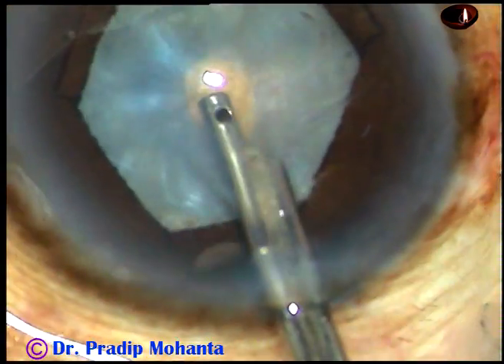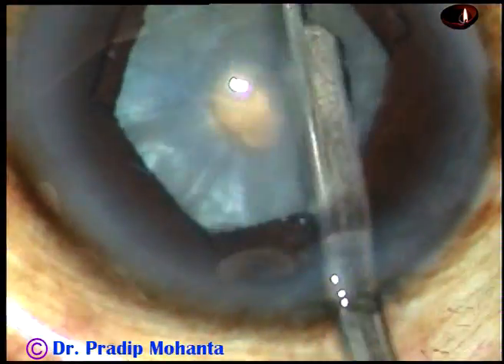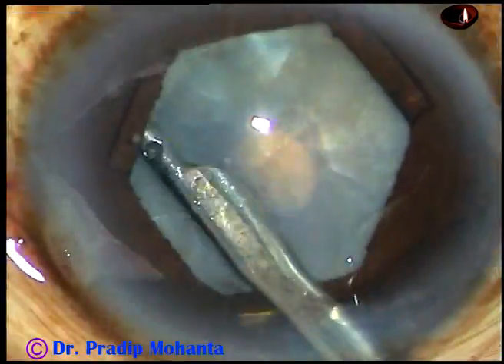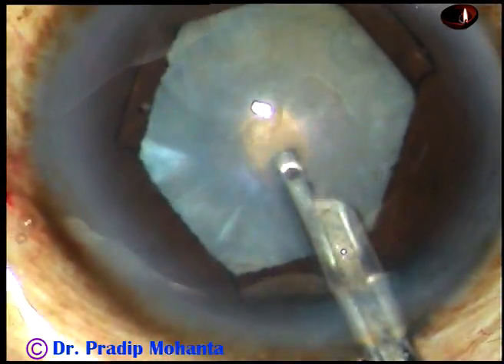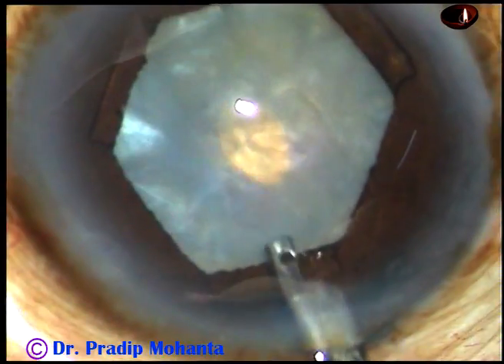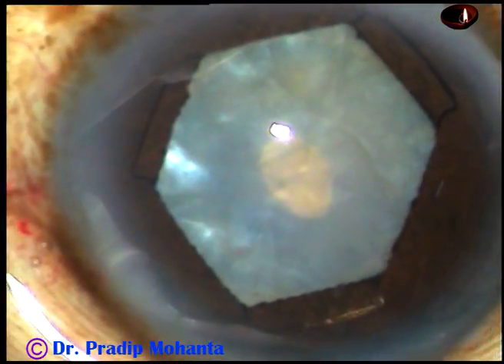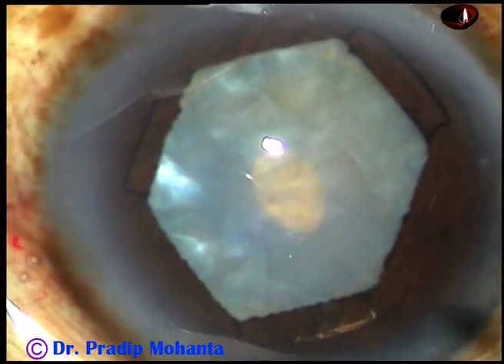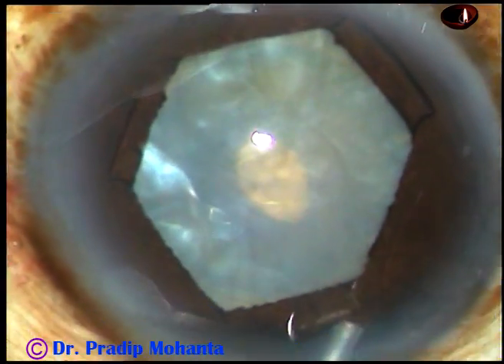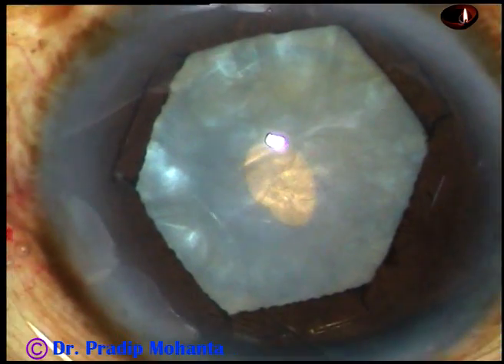And now I use a 23-gauge Simcoe cannula and aspirate some cortical matter to reduce the intra-lenticular pressure. If you reduce the intra-lenticular pressure, it is no longer an intumescent cataract — it is an ordinary cataract.